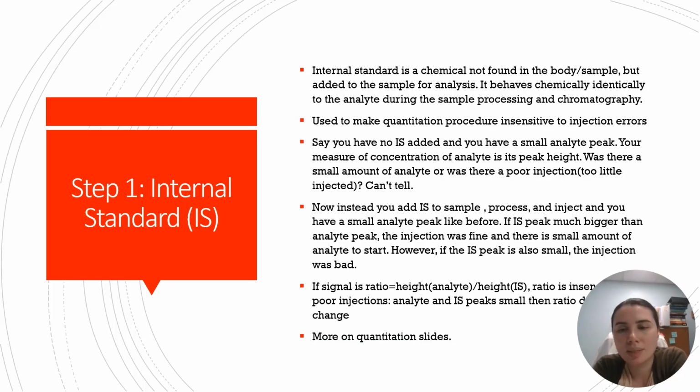Step 1, what is an internal standard? So it is a chemical that is not found in the body or sample, but can be added to the sample for analysis. It needs to behave chemically identically or as close to the analyte of interest as possible during the sample processing and chromatography. It is added to make sure that nothing went wrong during your sample processing or during analysis.